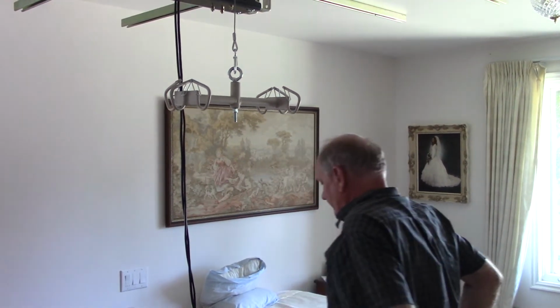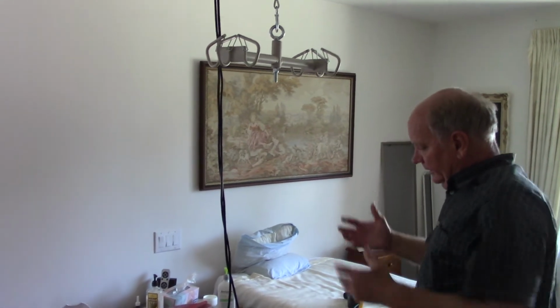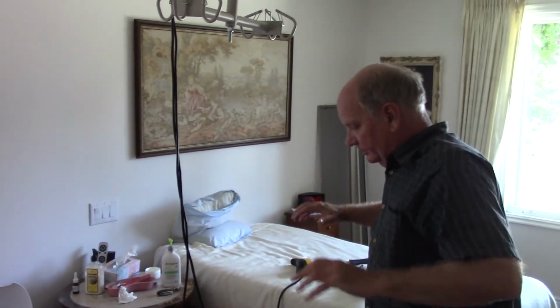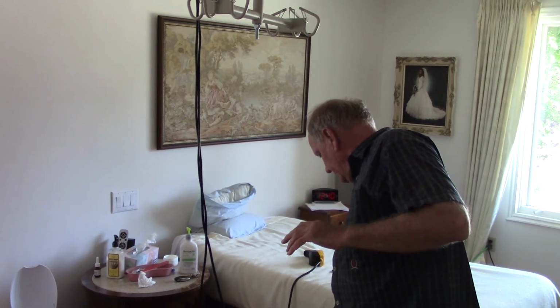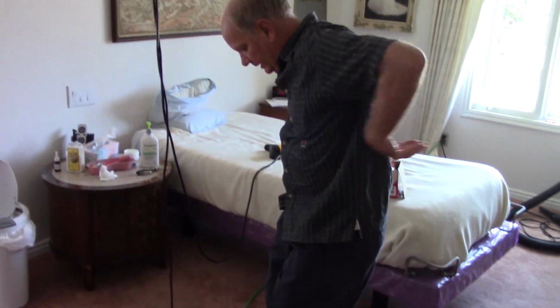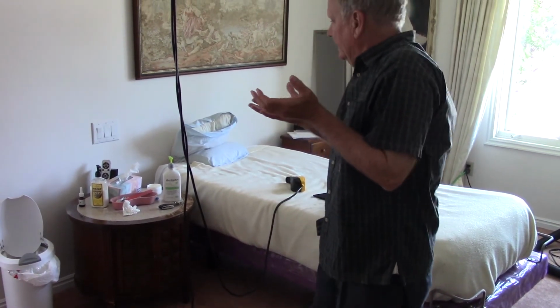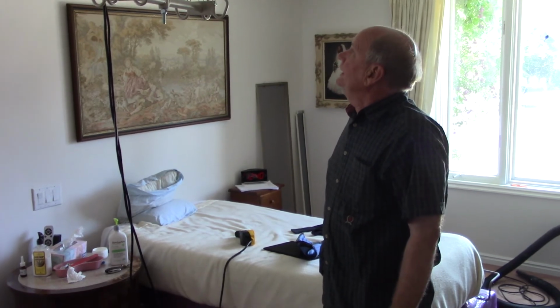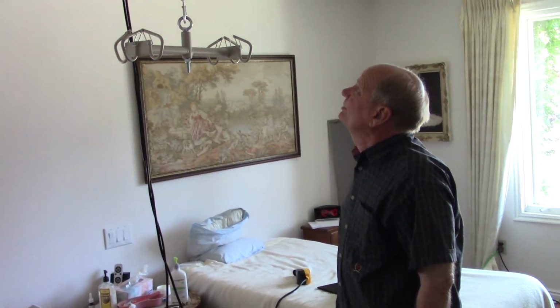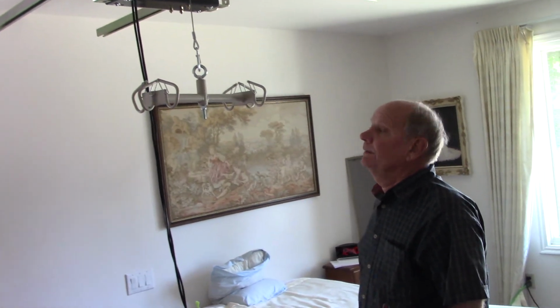It worked very, very well for us, and made it so that we could lift her from her chair. We could put the sling under each leg and behind her back, and then under each leg in the chair, and then just lift her up and swing her over and put her down in bed where we wanted her. So that's the crane. It was actually pretty cool. We used it a lot. Now I'm going to take it down.